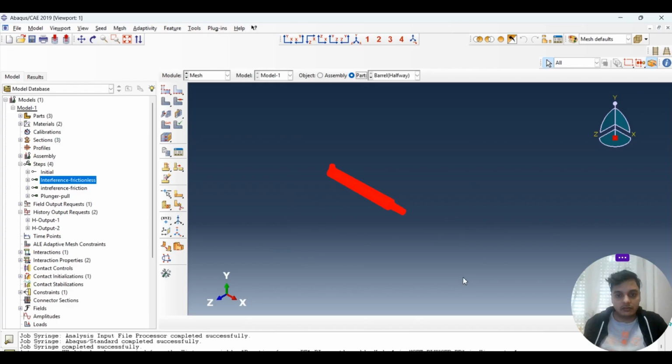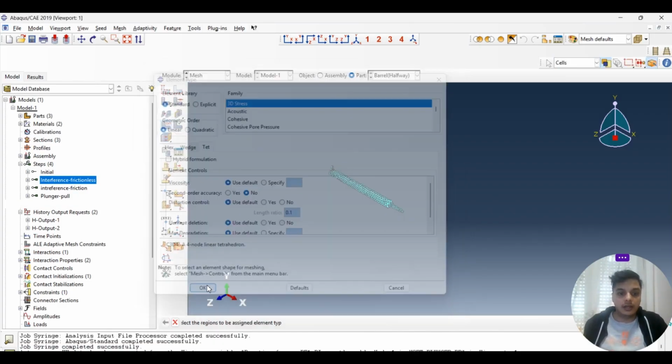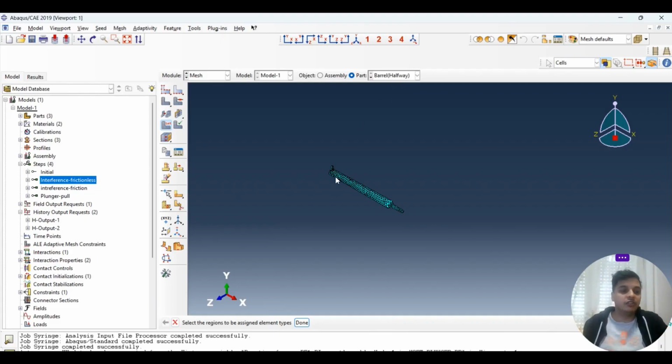For example, what I did, I just select the part, then I have to select the element type. So the geometric order, I just change it from quadratic. By default it's going to be quadratic. I change it to linear, and that's what I did for all the parts. So that's the second change I did.